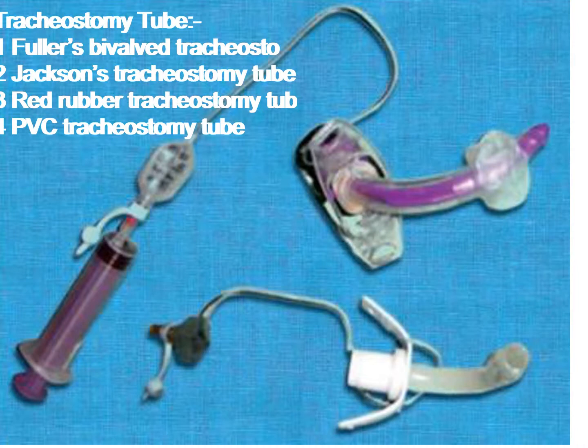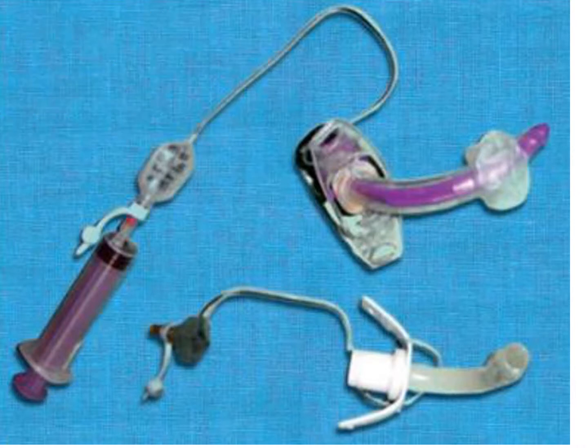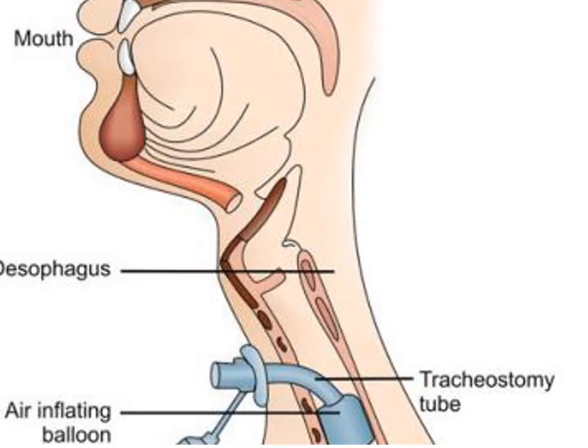They are soft, least irritant and disposable. They have inflatable cuff which makes it easier to give assisted ventilation. Cuff should be deflated at regular intervals to prevent tracheal pressure necrosis.